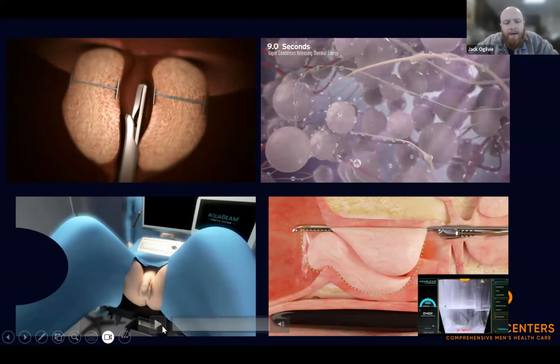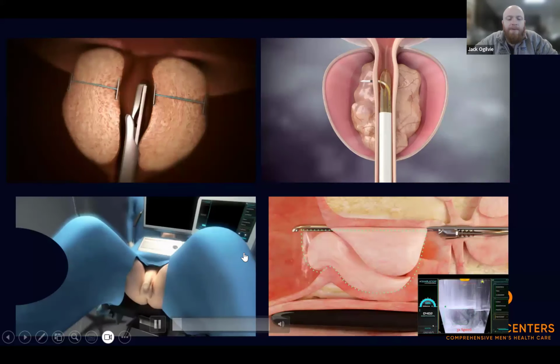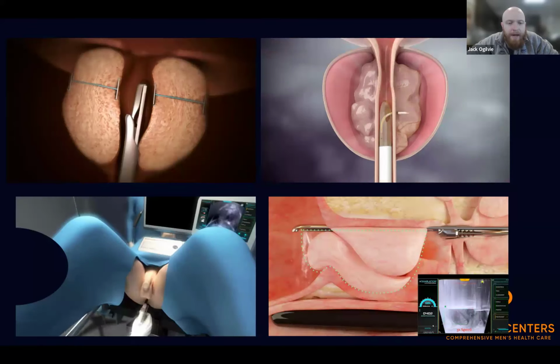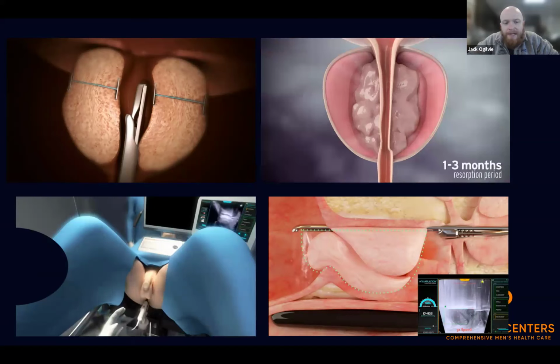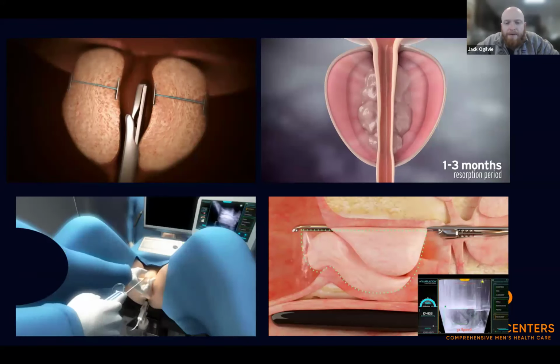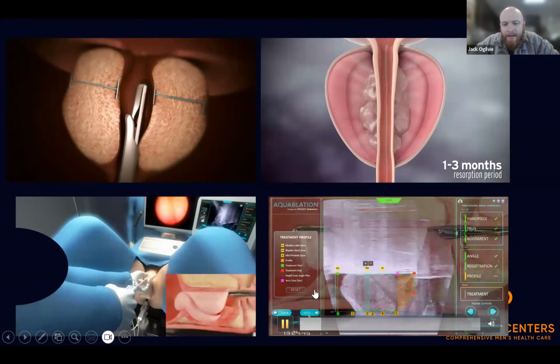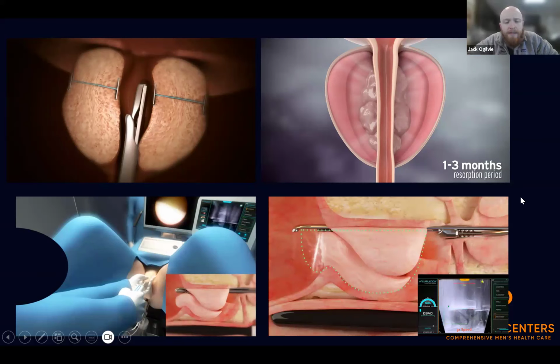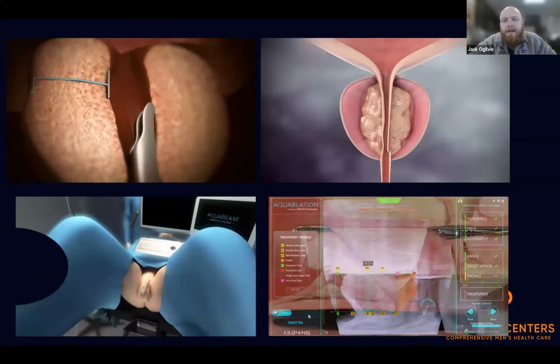And then along the bottom here, one of the newer procedures that the urologists are doing through the urethra is something called aquablation, where they very precisely use ultrasound to guide a device going in the urethra, and then use a high power water jet to essentially carve tissue out from the prostate from the inside. On the right here is what that looks like as it's being done. There's a device sweeping back and forth, and it's cutting the tissue out. So again, these are all great options in the right patient. But they all require that transurethral approach. A lot of these require general anesthesia. They're a bit harder as far as recovery and things like that.